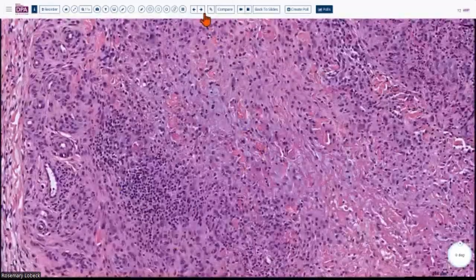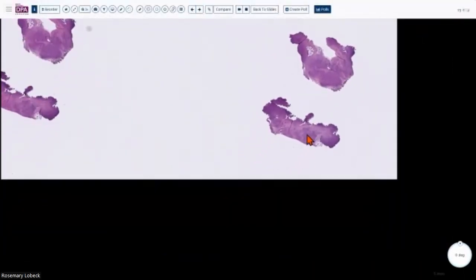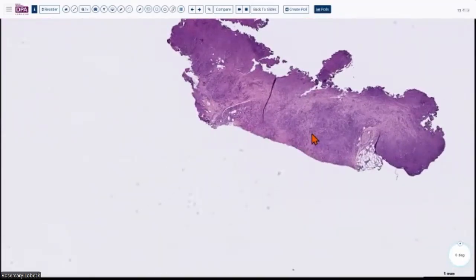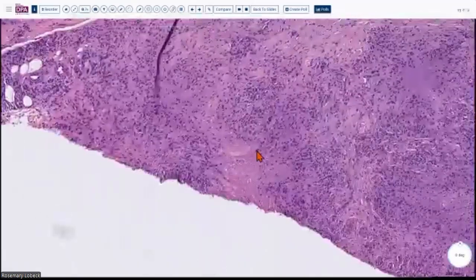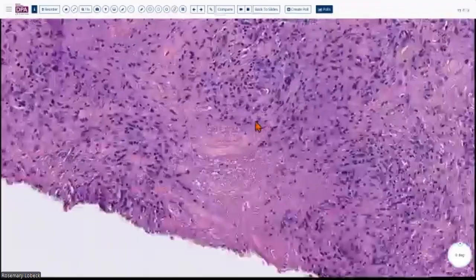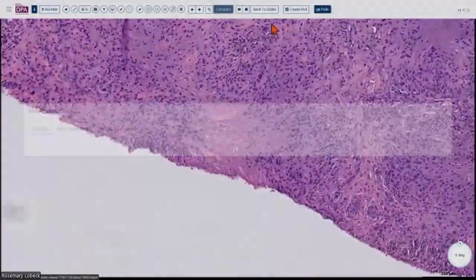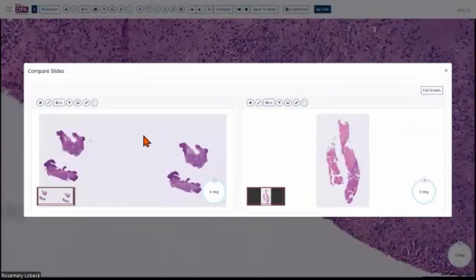But let me show you one more case here. So this is a case of granuloma annulare. Right? Again, in a young patient, epithelioid sarcomas do occur in young patients. So in the granuloma annulare, you don't see too much inflammation, but you see a similar type of epithelioid-looking cells and a central necrobiosis. So I'm going to do my comparison here. I'm going to pick my case of epithelioid sarcoma and put them side by side.